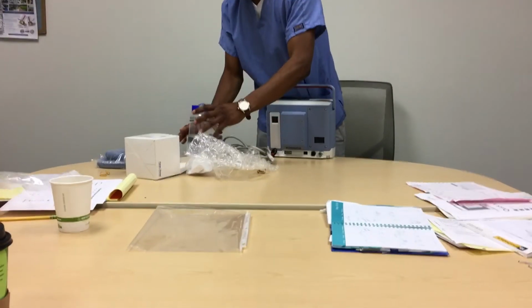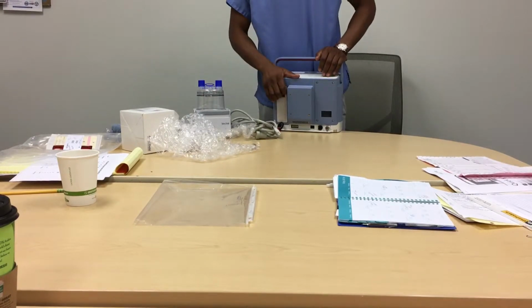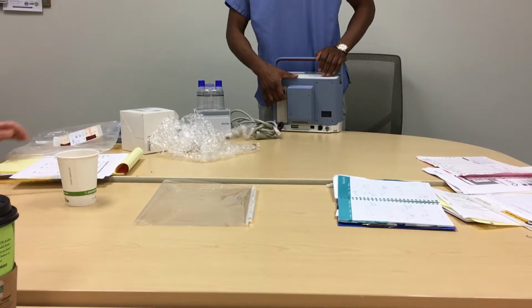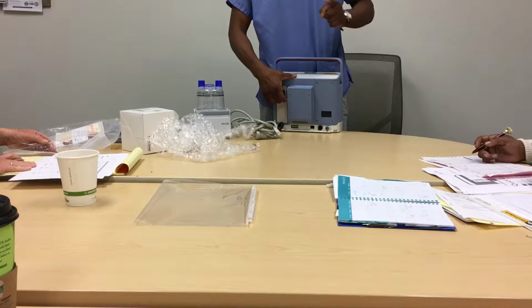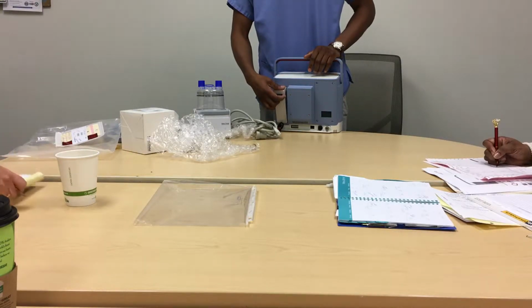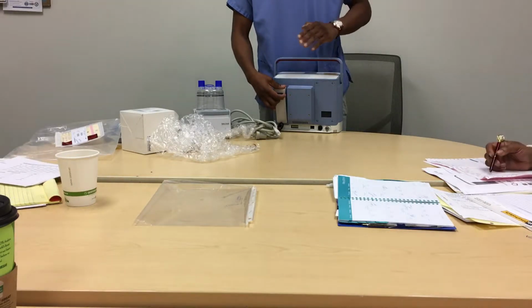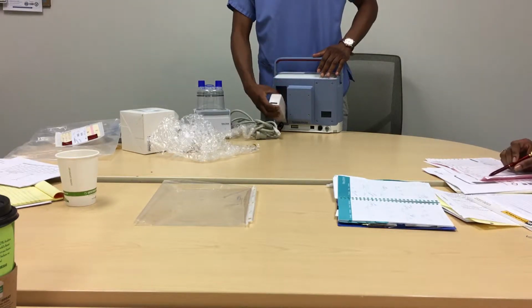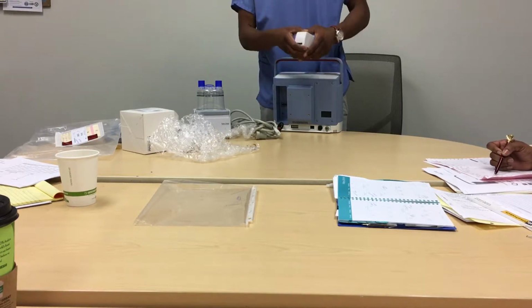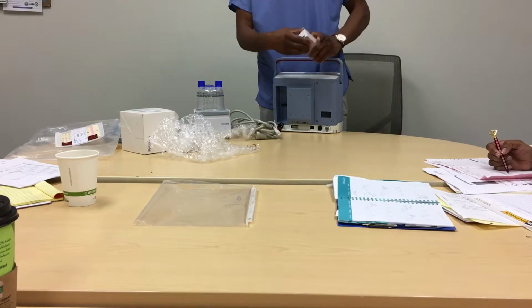Okay, it's recording. So the Trilogy 100 comes with an internal and an external battery. Combined, if there's any power outage, it will go for about 6 to 8 hours, depending on mode. So the external battery pulls out, and you can check on the battery life, right? It sits in.